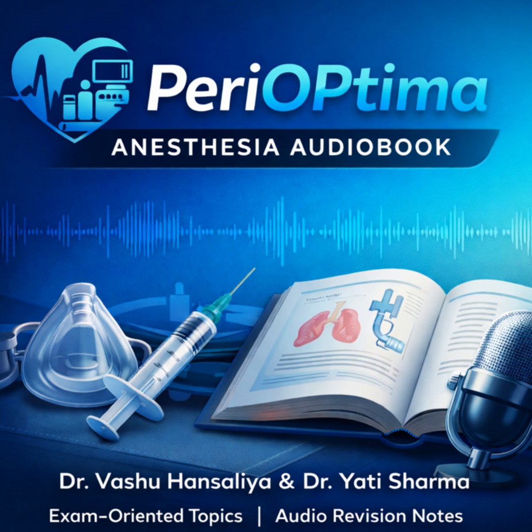Got it. Okay, finally, the fascinating cuffless favorite, the iGel. This seems like a completely different concept. It is. The iGel is categorized as a cuffless, anatomically pre-shaped sealer. It's almost like a thermoplastic boot. It's made of a unique polymer that, once it's inserted, warms up to body temperature and softens in place. Oh, that's clever. It is.